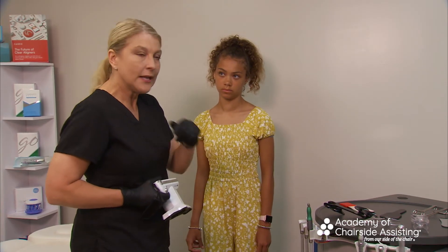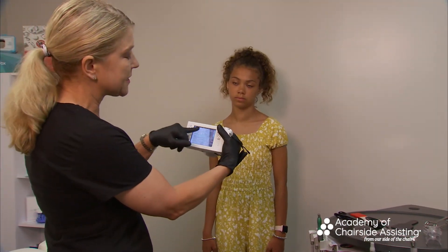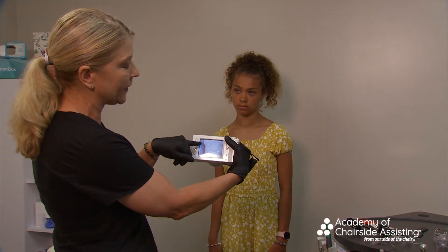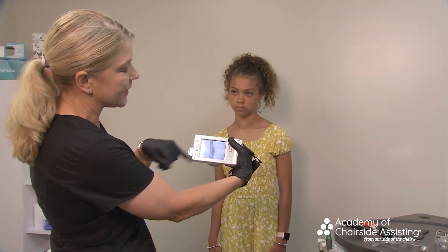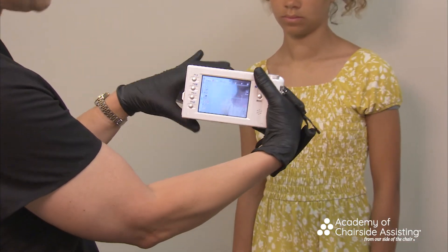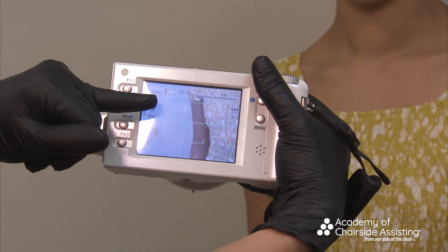With the Shofu camera, when you turn it on you can see whether you want a close-up or to be further away. The key area to look at is face mode. It's touchscreen, so when you turn it on you'll see red, yellow, and green — just like a stoplight. Touch the screen and select the mode. The first mode we're starting with is face mode for a nice smile shot.